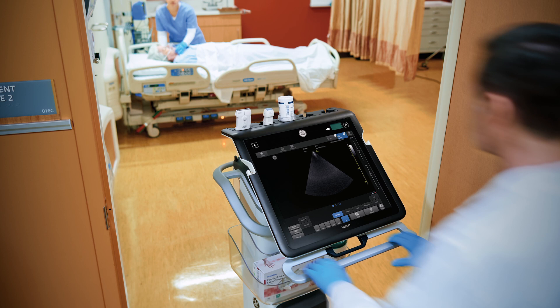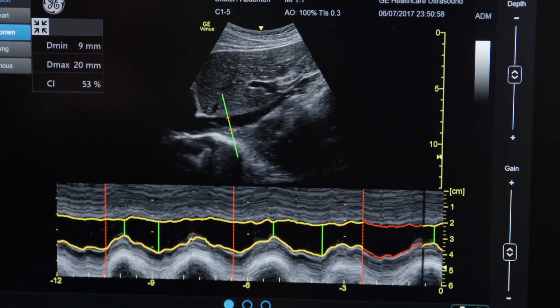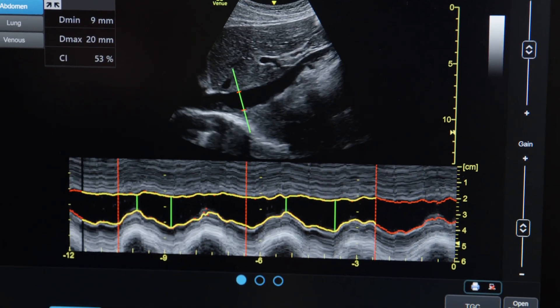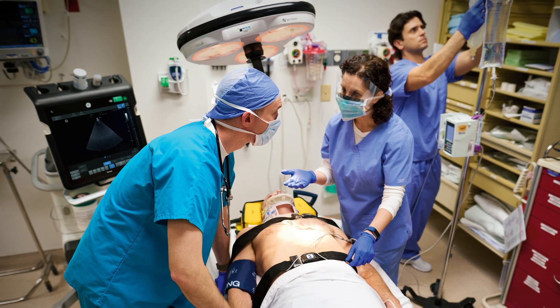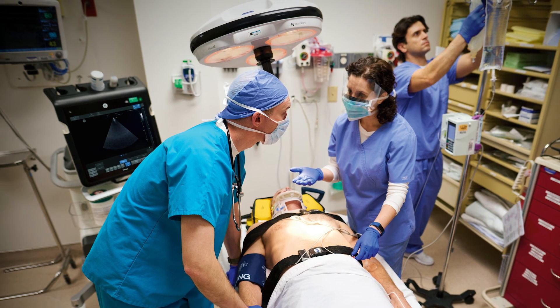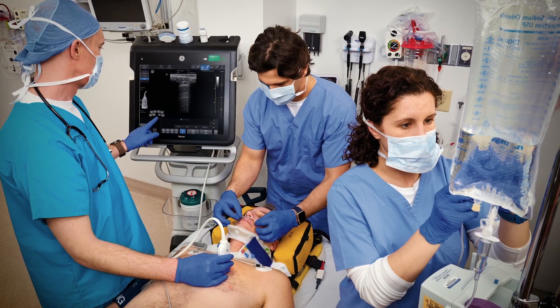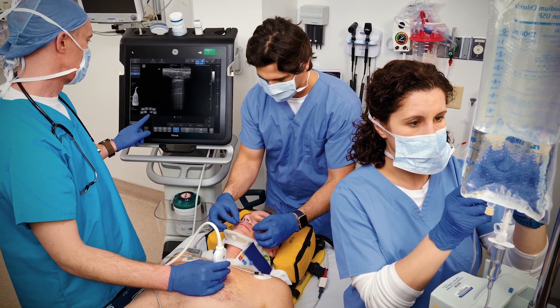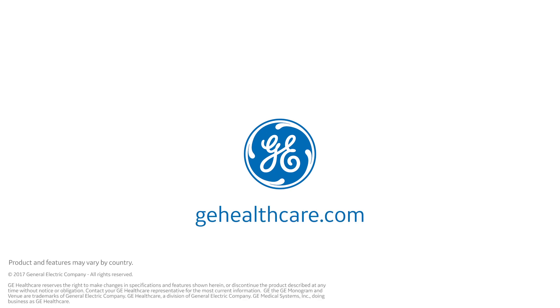Venue Ultrasound System — a system designed to help you quickly get the information you need to make fast decisions when triaging patients, including those in shock. Learn more at GEHealthcare.com.